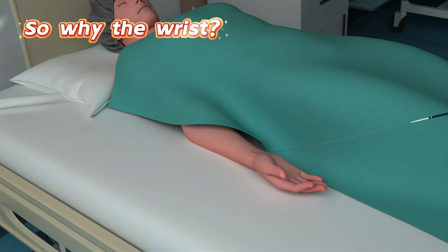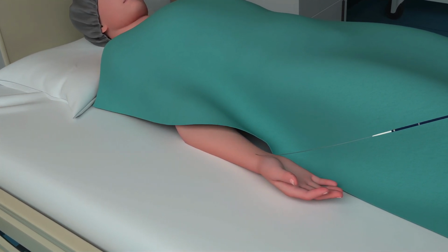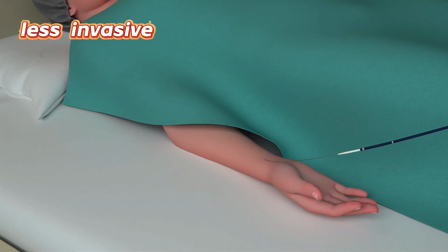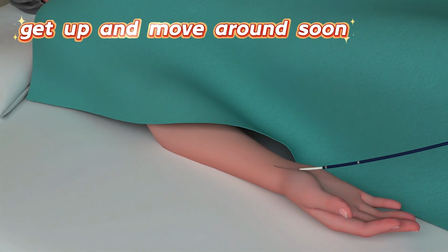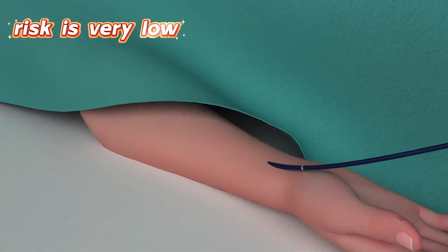So why the wrist? Isn't that taking the long way? They choose this spot because the artery in your arm leads directly to the heart. It's less invasive, leaves no visible scar. Patients can get up and move around soon after the procedure, and the risk is very low.